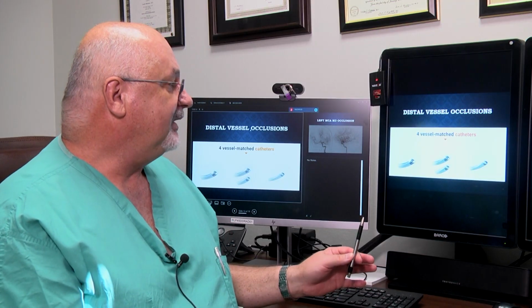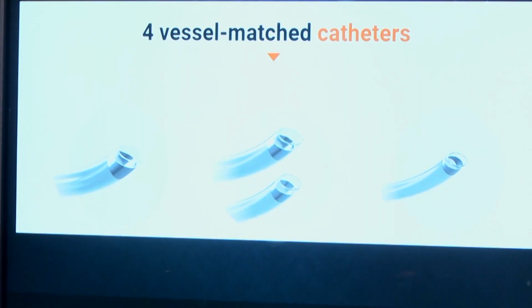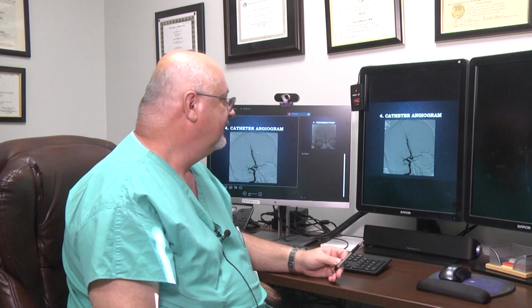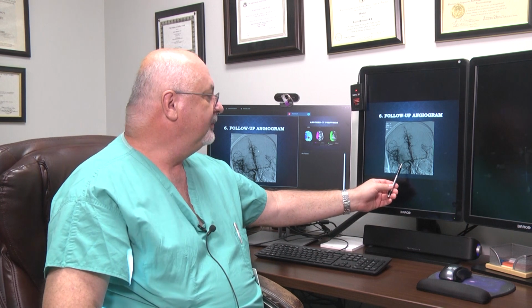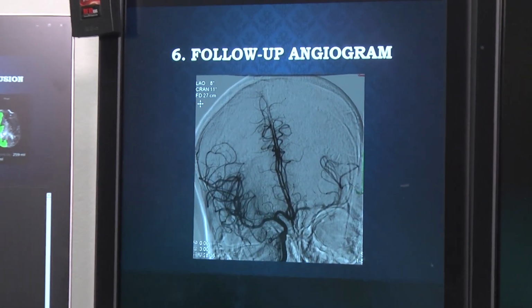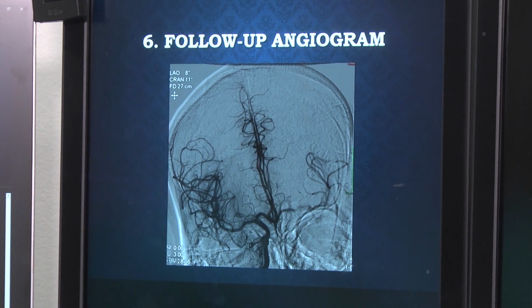Fortunately, in such cases, 10, 15 years ago, some devices were invented which are able to reach those areas of the brain, and they can treat the large vessel occlusions. We went up with a catheter and ended up with complete reopening of that blood vessel, and now you see that the right hemisphere receives sufficient amount of blood, and the patient neurologically improved by the next day. The patient was back to normal.